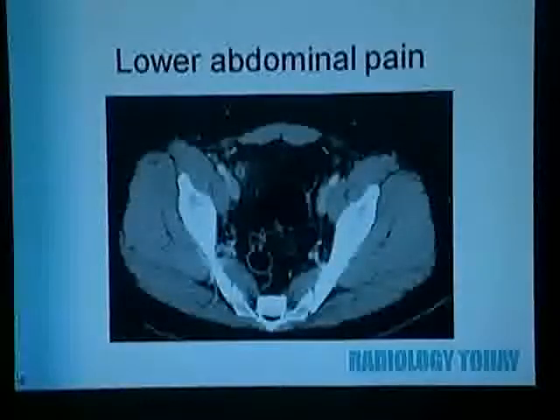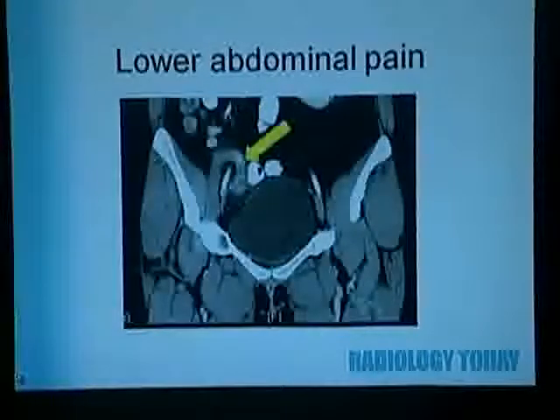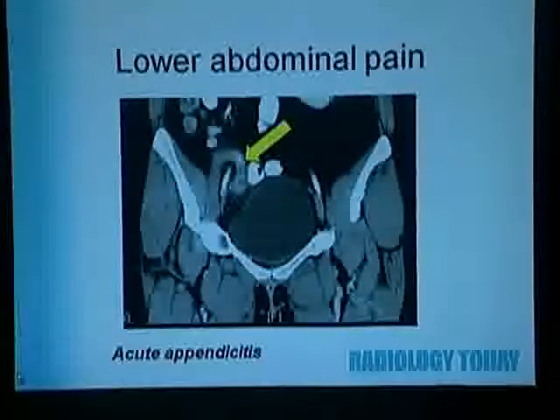Now, CT in the acute setting is our first choice test, a tailored CT. And this is often the source of what we're looking for in right lower quadrant pain. We have an inflamed tubular structure in the right lower quadrant. There's a small appendicolith, and this was acute appendicitis. So not only do we use the CT for diagnosis of acute appendicitis, but also for looking for complications. If it's ruptured and has an abscess, they may require us to put a percutaneous drain in.